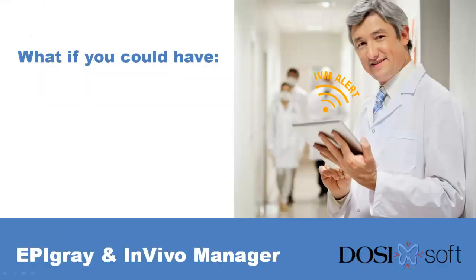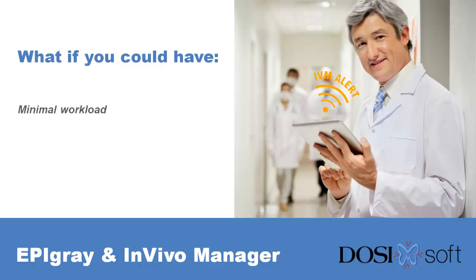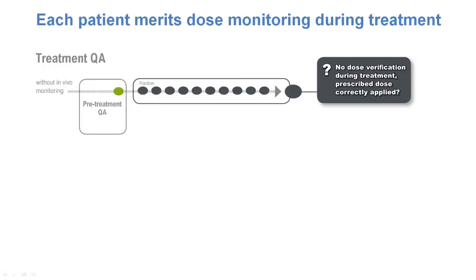What if you could control with your EPID device that the right dose is delivered safely to each patient, fraction by fraction, with minimal workload for your radiotherapy department, with secure remote and immediate access to treatment statistics, when needed, where needed. We believe that each patient merits dose monitoring during treatment.